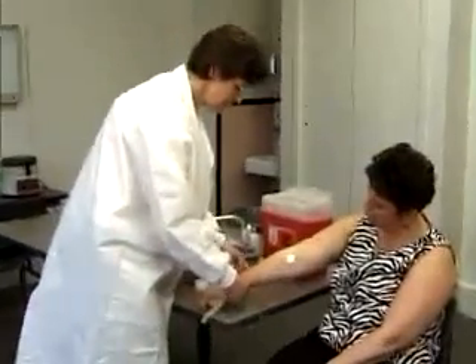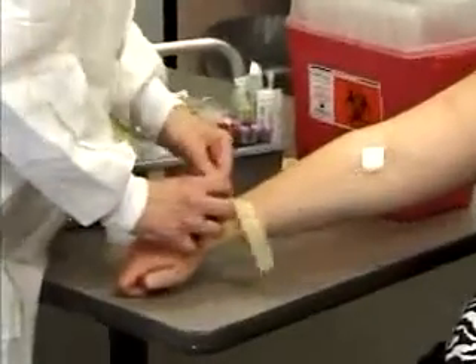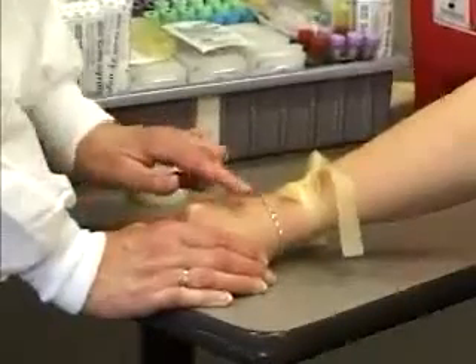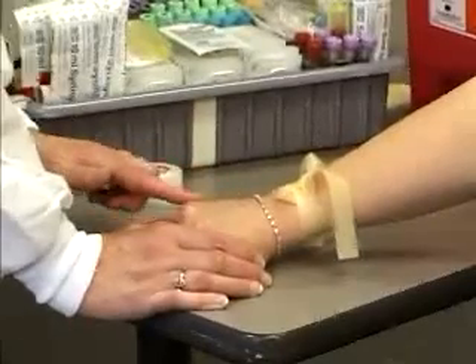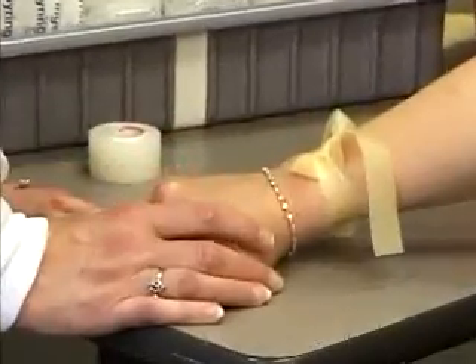Tie the tourniquet around the wrist, getting it fairly tight, and palpate across the back of the patient's hand. This patient actually has about four veins we could use. You want to make sure the vein is very straight and know which direction the vein is going.